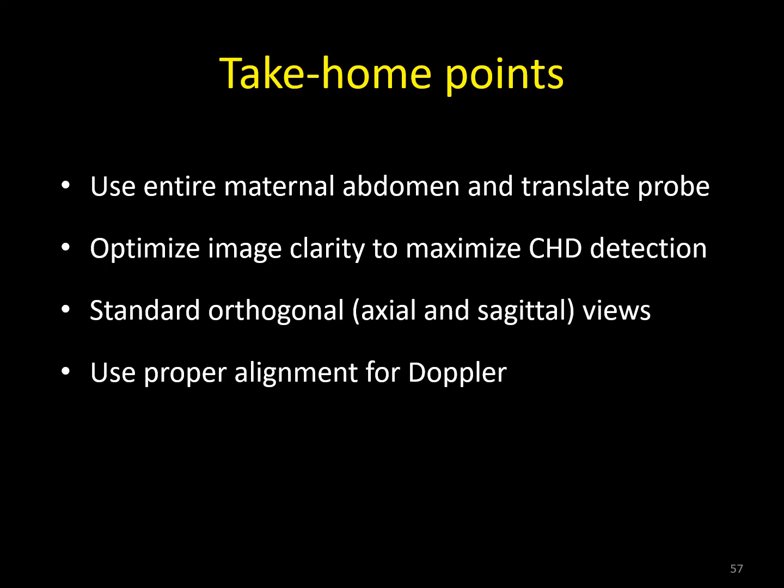Standard orthogonal views: all of the views I've shown are proper views used in conventional fetal echocardiography, and it's important to try to replicate those views. That's the best way to show the cardiac structure and the alignment of images for interrogation, and specifically in Doppler interrogation. You need to have the images aligned appropriately so that you yield the best and most accurate information for Doppler.